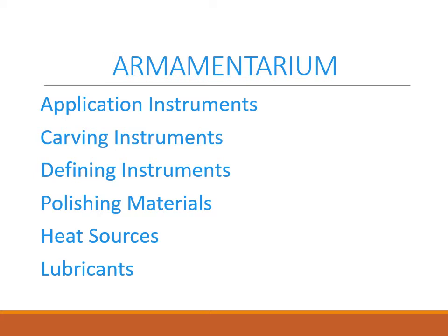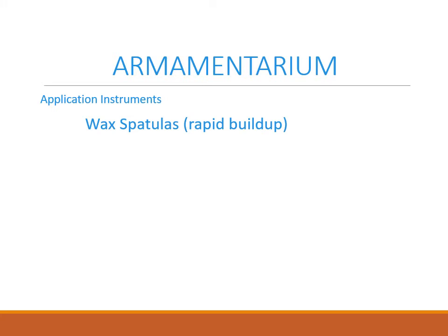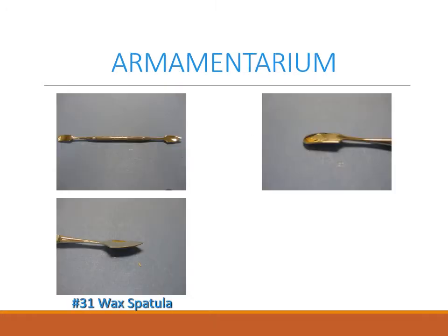For this first part, we're going to be looking at some application instruments, which means you will use these to apply wax to your die. And the first one we'll show you are the wax spatulas that you will use for rapid buildup of wax.